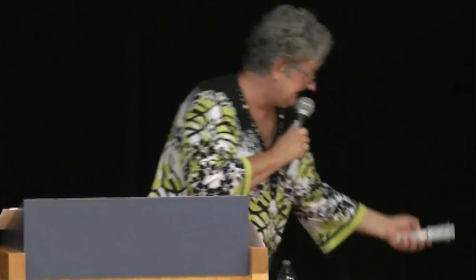So depending on the size of the student and the dose, that plunger might be out just a very small amount. Let's say this is a small preschool student. Doesn't need a lot. If it's a larger student, the plunger might be out quite a bit. You're not going to worry where the plunger's at. It's where it needs to be for the dose that you need to administer.